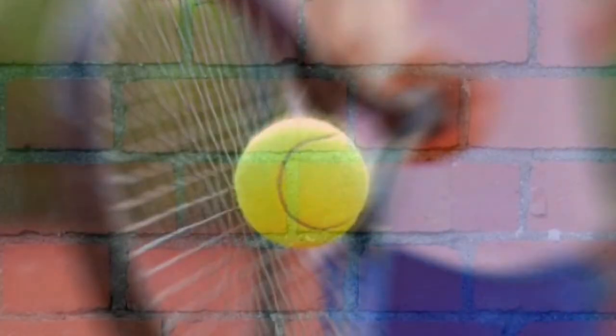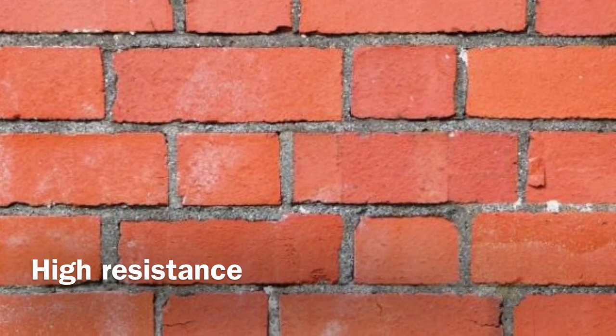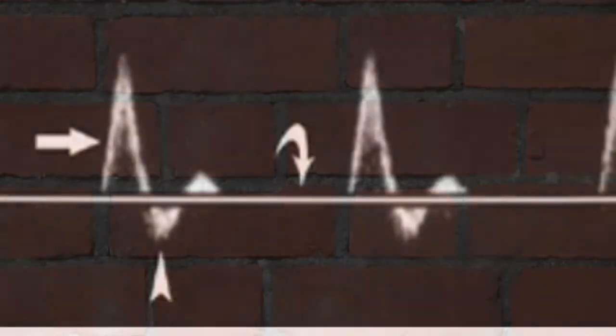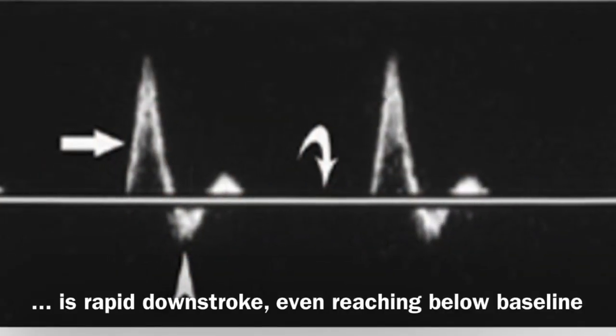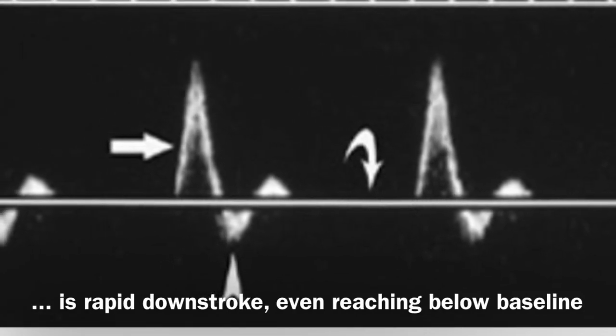And depending on the state of resistance in the distal arterioles, the downstroke may be rapid, indicating high resistance, where the high jet of blood flow faces a concrete wall and sometimes bounces back, creating a below baseline small wave.